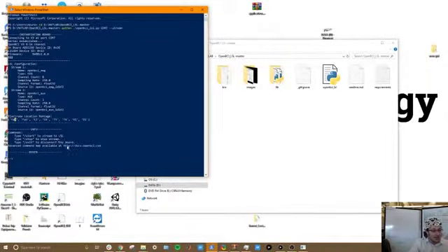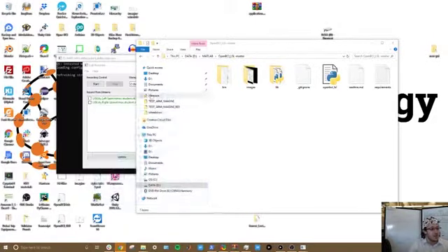So now that we know I'm getting a good stream, the first thing I'm going to do is set up a connection to LSL. So I'm going to type /start. Another thing to remember is when you want to stop doing this, before you turn off any of the hardware, you must type /stop and then /exit so that it disconnects from the hardware. Then you can turn off the hardware, because otherwise you end up having to reset all of the hardware again if you want it to connect correctly, because otherwise you end up with this problem where it won't connect for some reason. So now that we have the LSL stream running, you should be able to see it here.